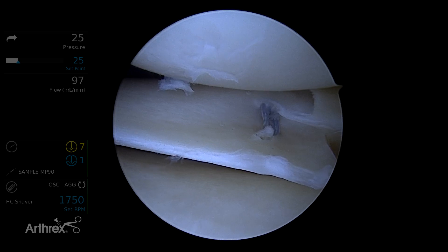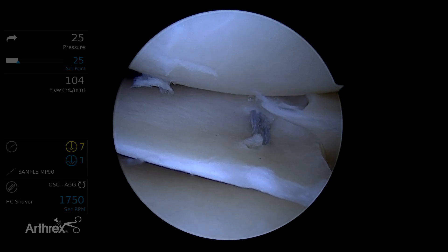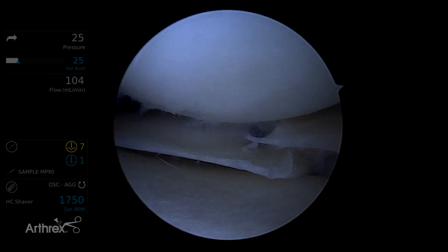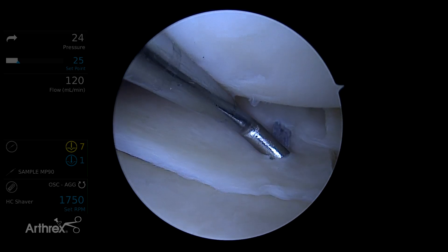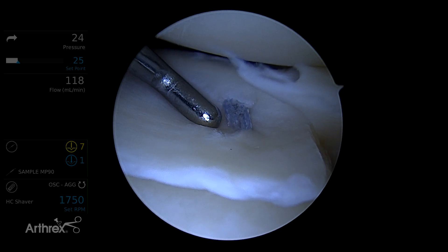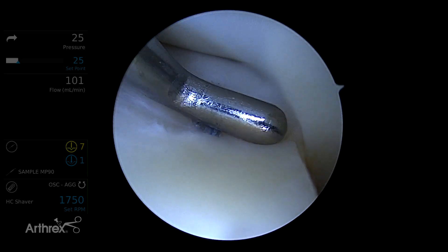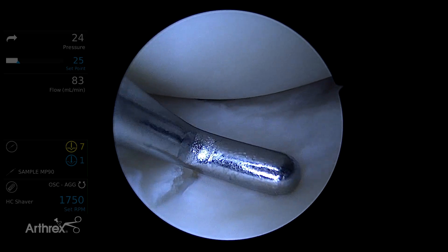Here we see the first vertical stitch in the posterior element of this radial tear. It did two things: it reinforced it, and it actually holds the meniscus if it were mal-reduced and displaced posteriorly — it kind of presets this posterior element against the capsule. Remember, these anchors go out the capsule, and it's all suture, so it's friendly to the knee. There's no device out there, just the suture knot on the backside of the meniscus at the capsular junction. We're going to bridge across this and use the tension and strength of this suture repair to reinforce the meniscus so the horizontal suture doesn't rip out through the end of our injured meniscus. Now we're going to put a second one on the anterior element of this radial tear.